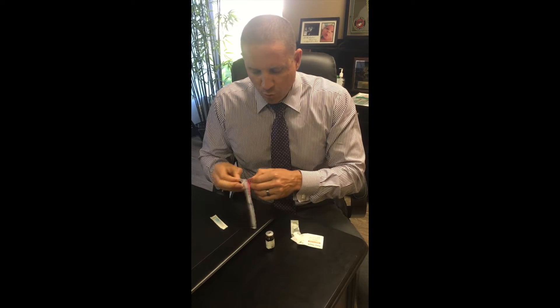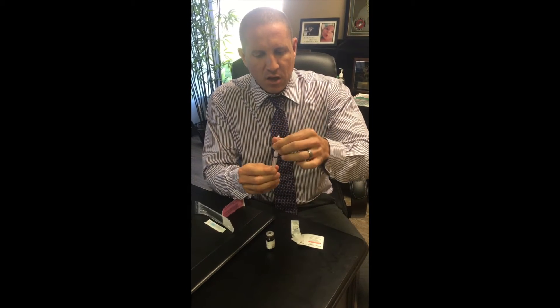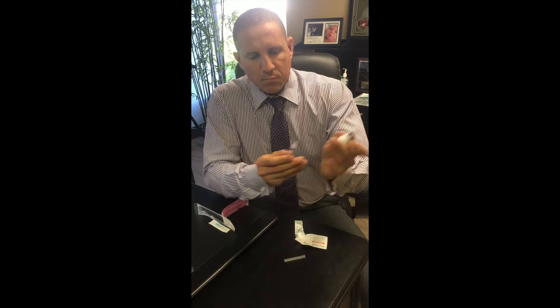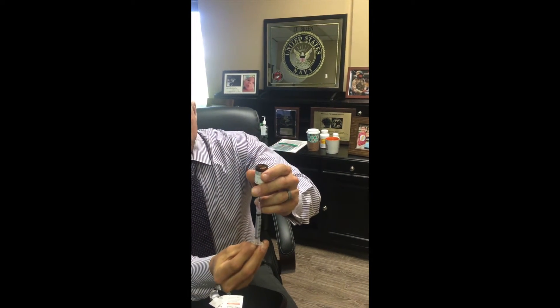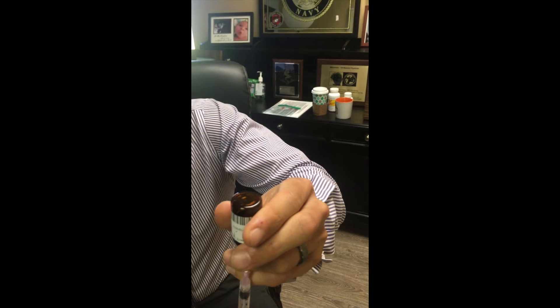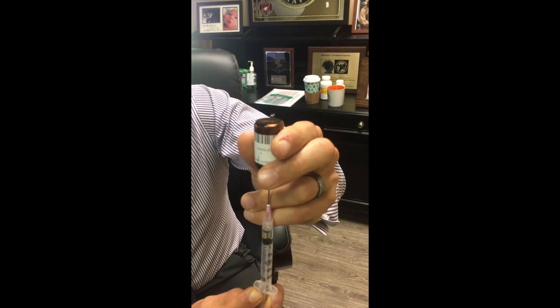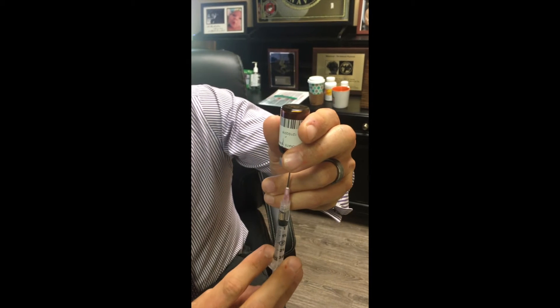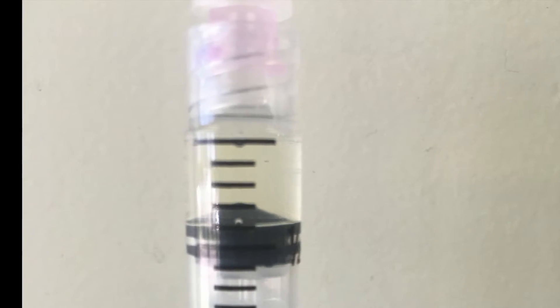This is sterile, so you'll take this needle off, turn the bottle upside down, and bore this directly into the center. Then you're going to pull out to the 0.4ml line. As you start withdrawing the needle you'll see the testosterone start coming out — sometimes you have to pull back a little further and then press back down. Here's the 0.4 line right there.